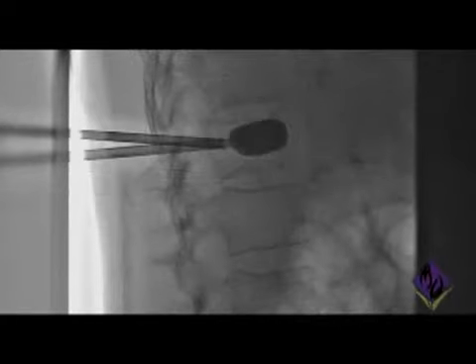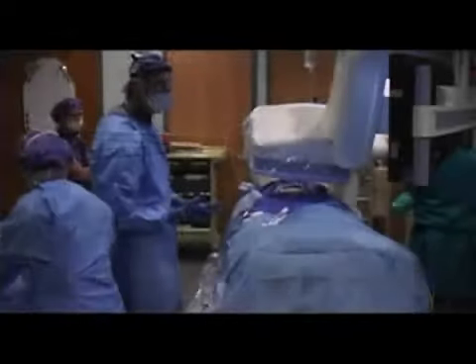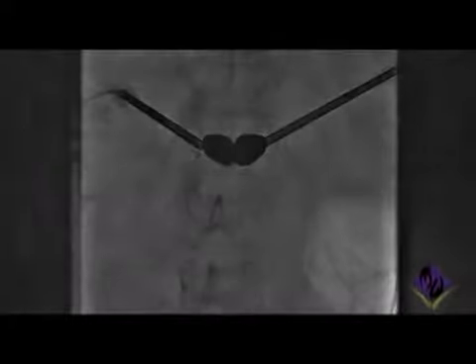I think you can see on this last image we just took, the superior end plate has now migrated superiorly, which is one of the things we want to achieve by this. Two things we want to achieve. One is alleviation of the pain. If you can restore the height of the body, then the biomechanics will be significantly improved. And then on the AP view, you can see these two kissing balloons, really well situated.